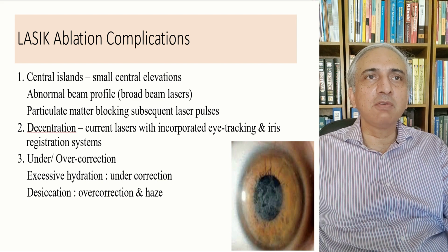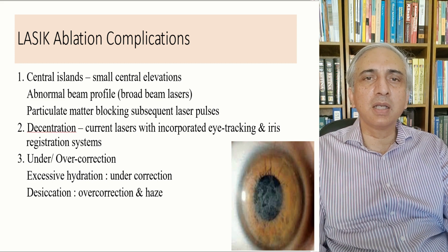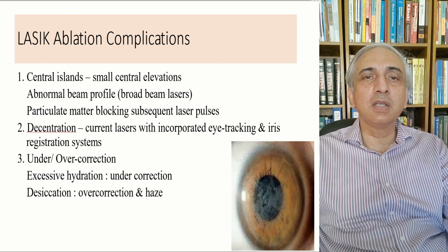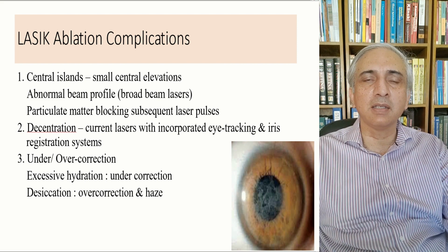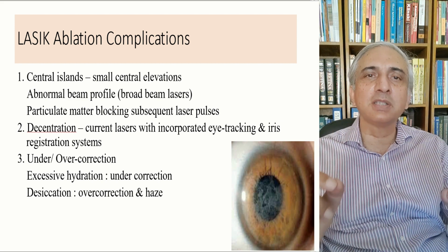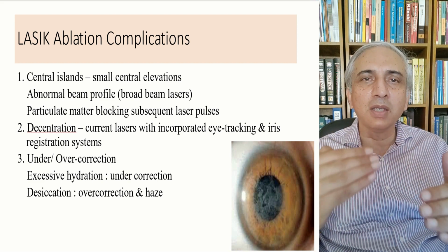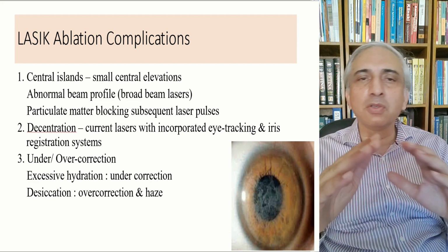Excessive hydration produces undercorrection, so you need to have a dry cornea before you do surgery. But if it over-dries, there is desiccation, overcorrection, and haze. So the timing of the surgery is important. Once you put the speculum on, things are go. You need to finish it and keep going. You cannot stop at one point and fumble around.